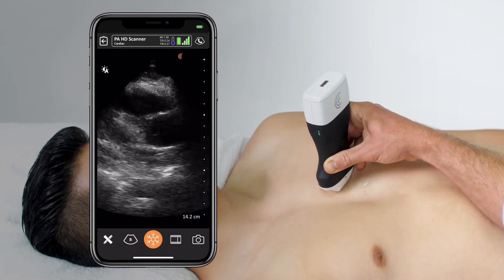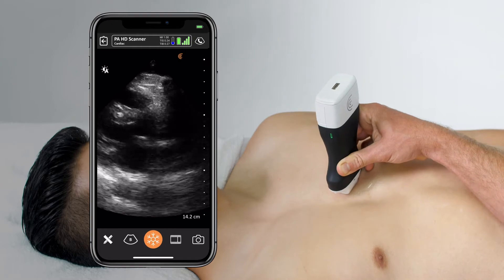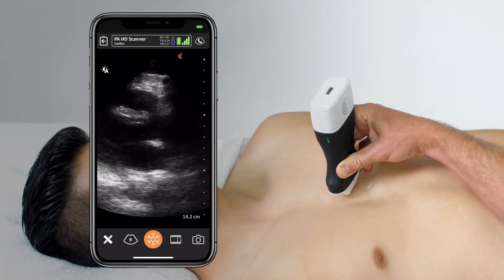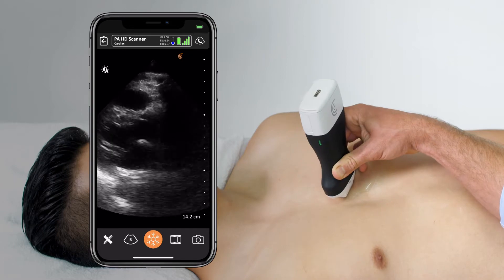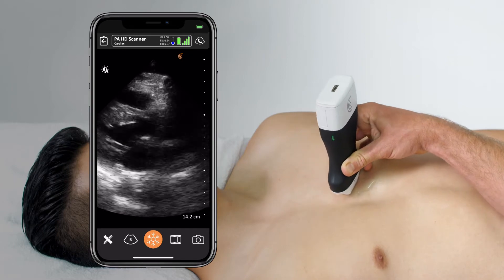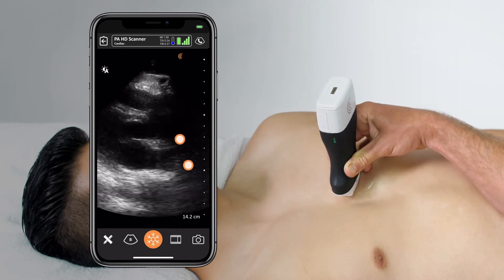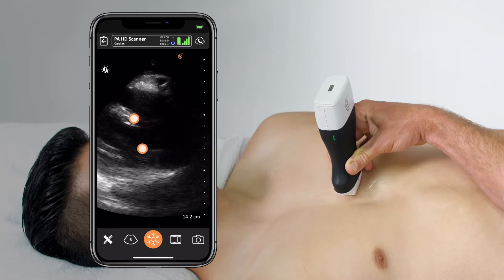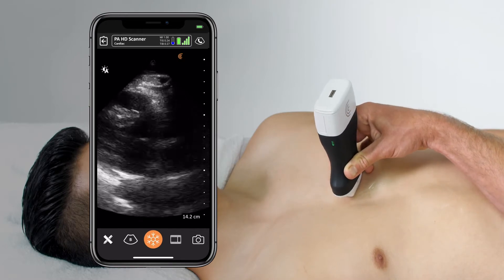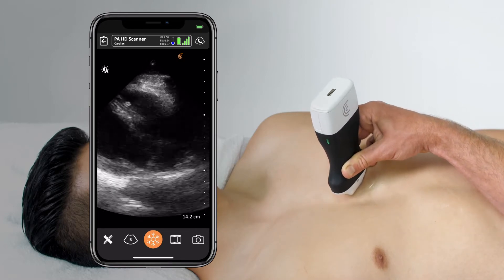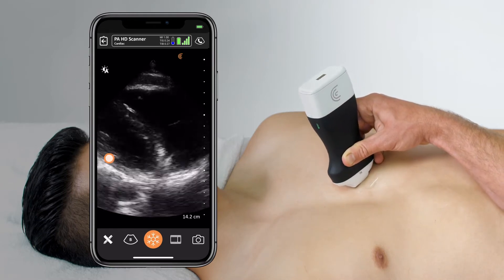Once I'm happiest with my window, from here I'm going to fan for the middle. That means tilting the transducer towards the patient's head or towards his feet to find the valves opening up at their maximal diameter. Once I'm happy with that, I'm going to then rotate the transducer to find the ventricle open up to its widest width.